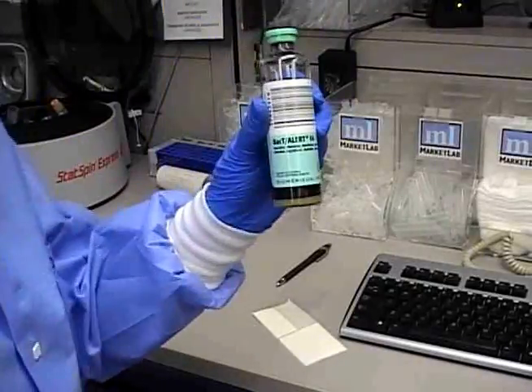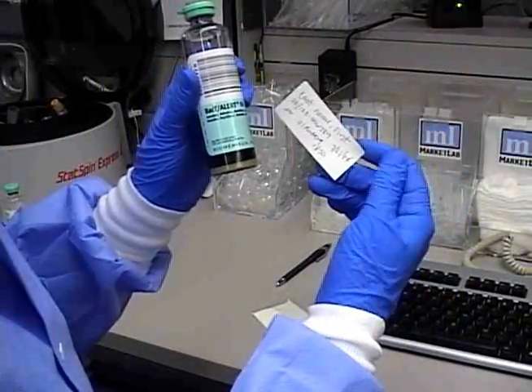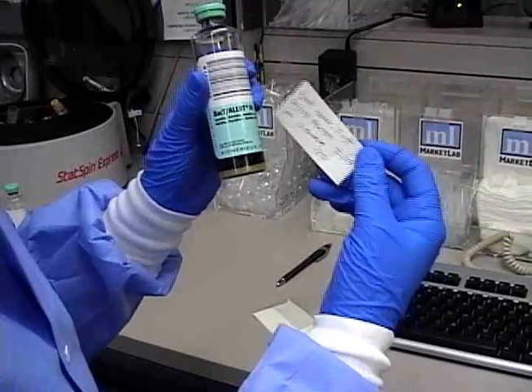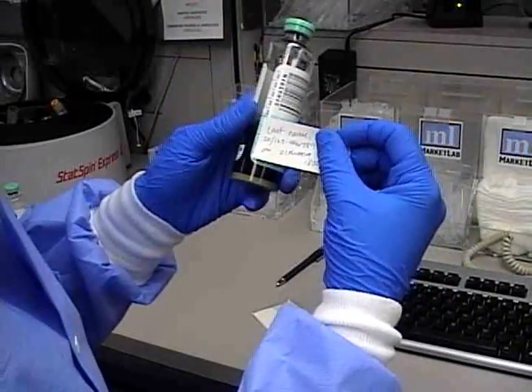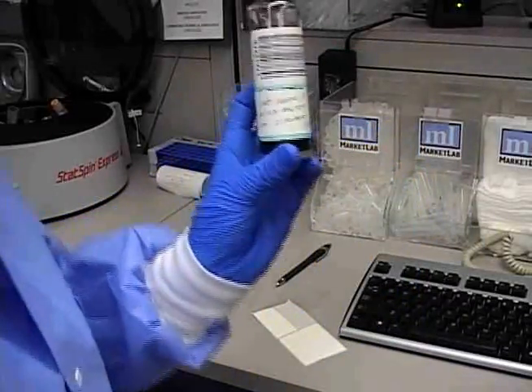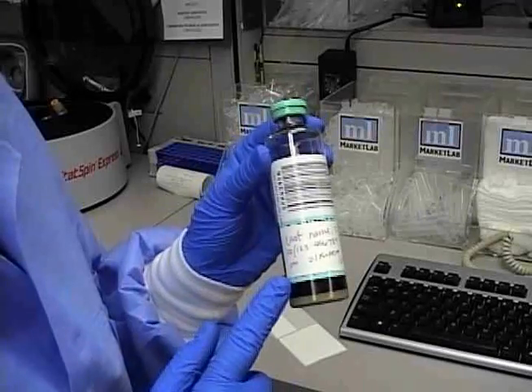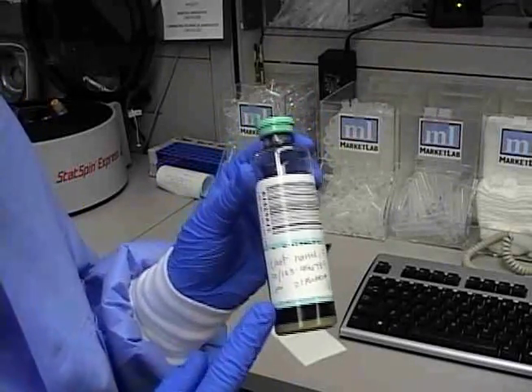Step 1, take the bottle. Step 2, take your patient label properly filled out. Step 3, line it up and put it all the way around. Voila, a properly labeled blood culture bottle.